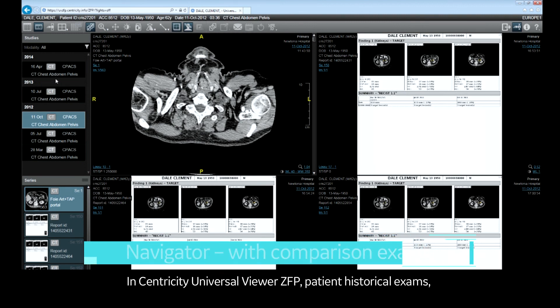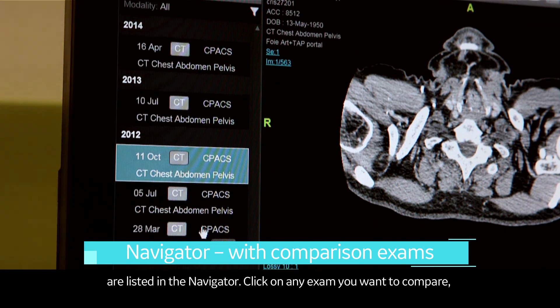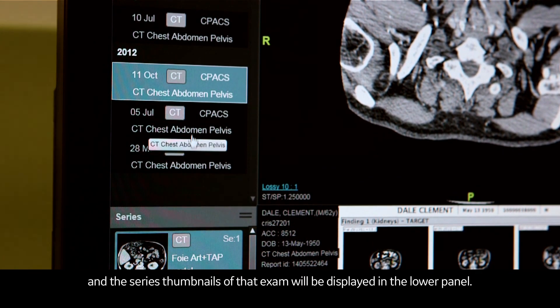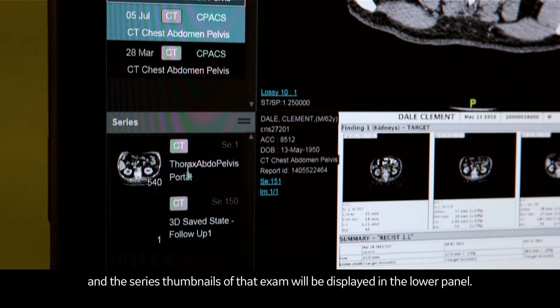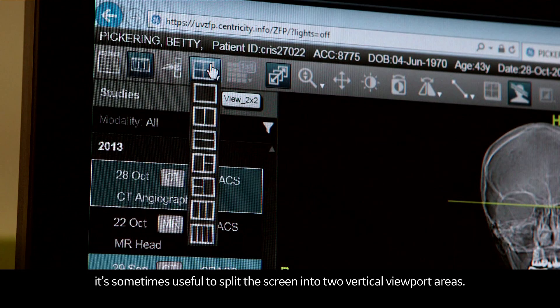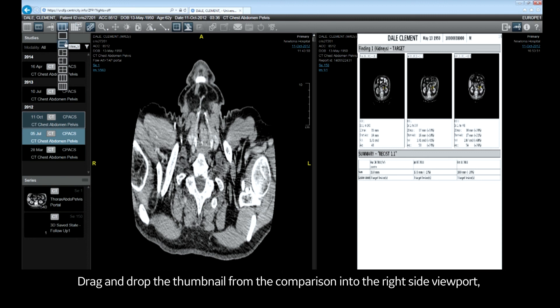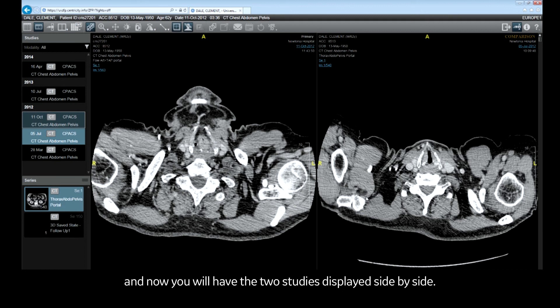In Centricity Universal Viewer ZFP, patient historical exams are listed in the navigator. Click on any exam you want to compare and the series thumbnails of that exam will be displayed in the lower panel. When comparing exams from two dates, it's sometimes useful to split the screen into two vertical viewport areas. Select from the list of available viewport types, then drag and drop the thumbnail from the comparison into the right-side viewport and now you have two studies displayed side by side.